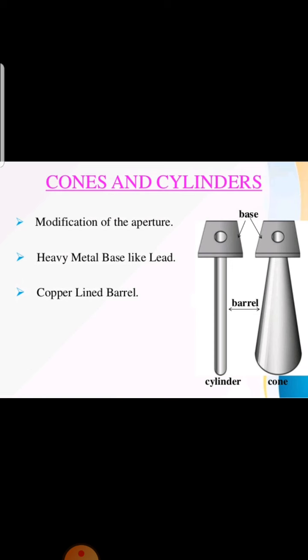One difficulty with using the cone is alignment. If the X-ray source, cone and your image receptor are not aligned on the same axis, one side of the radiograph may not be exposed because the edge of the cone may interfere with the X-ray beam, just like we studied in the diaphragm. So there will be cutting as well, just like in the diaphragm aperture. We will call it cone cutting. The same limitations apply as with the aperture diaphragm.